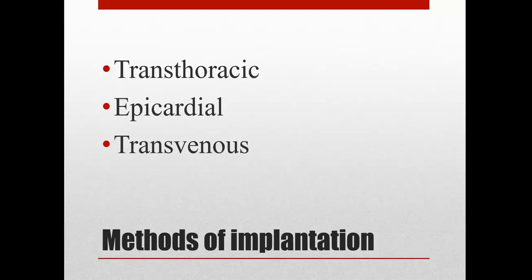The approach for implantation is through a right parasternal mediastinotomy into the right atrium. It has to be done under general anesthesia. I've never seen one of these done, but like I said, it's not typically really common for adults. So you may see it more in pediatrics, or in an adult who has some kind of problem, like I mentioned, and they're not a candidate for other ones.